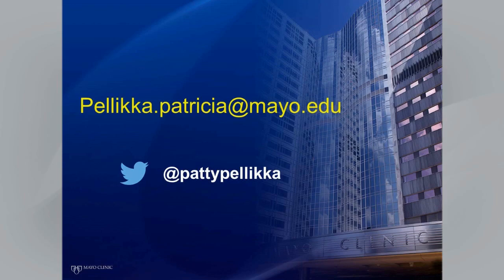We have tried an atropine study in patients undergoing a treadmill test and published these results, Dr. Attenhofer, several years ago, to see if it would help keep the heart rate up longer in the recovery period to allow more time to get the post-stress imaging, keep the heart rate up higher. But even giving atropine, the heart rate decreased exponentially in recovery.